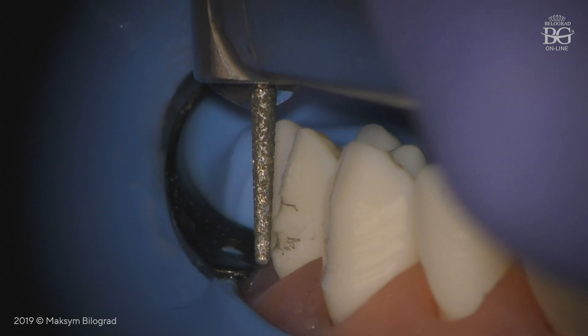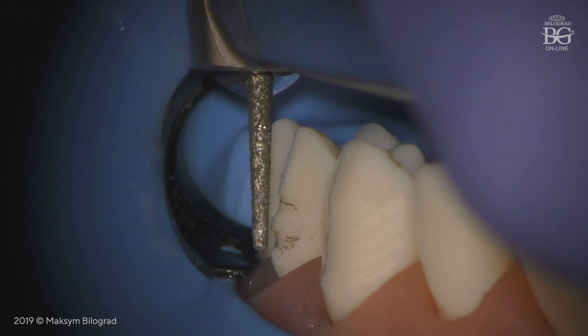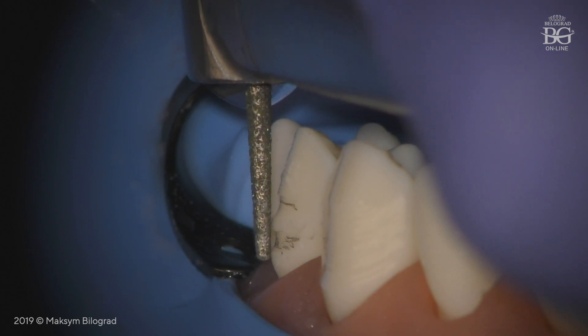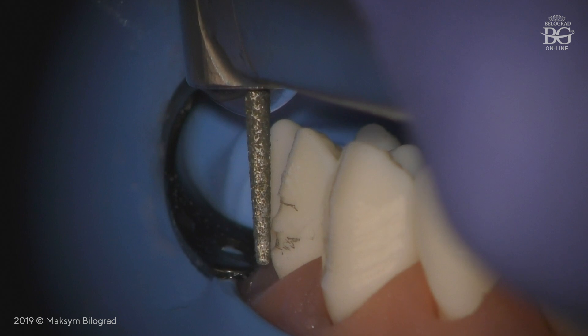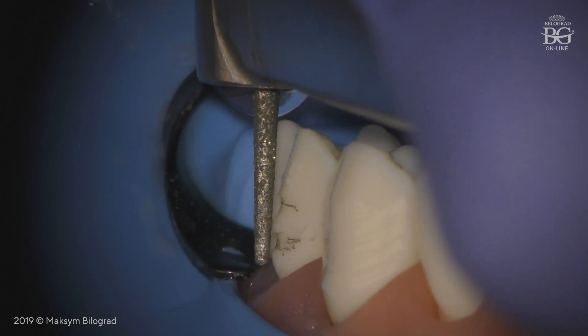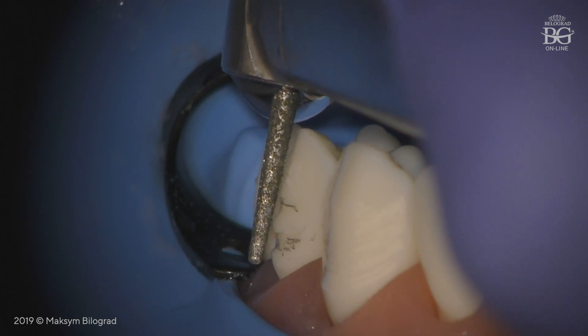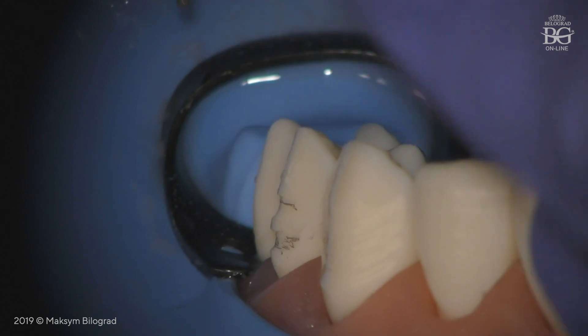The finish line, in our case, will be performed by itself if you keep your burr clear up to the cervical area. We have to keep the burr parallel to the bulbosity. Another mistake you may make is if you incline your burr more toward the incisal edge, resulting in too much tapered preparation.